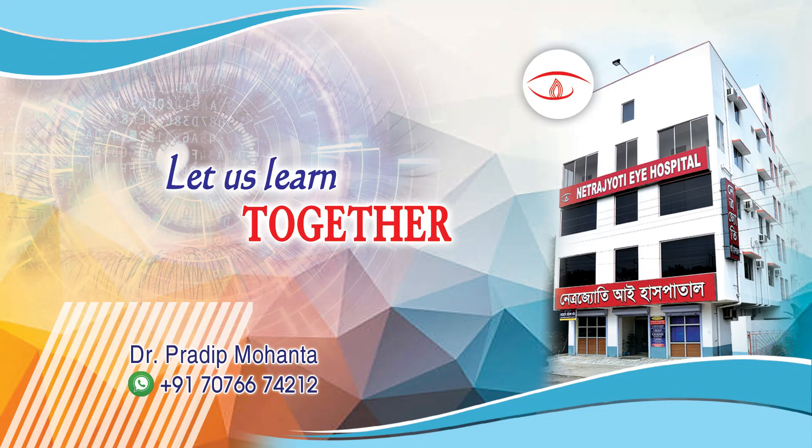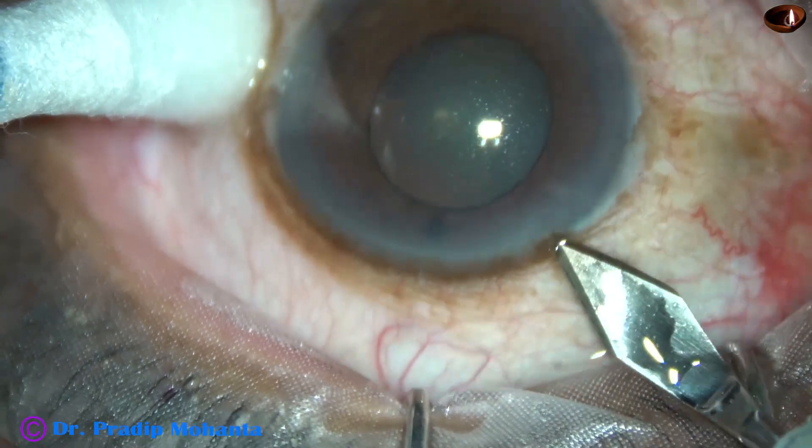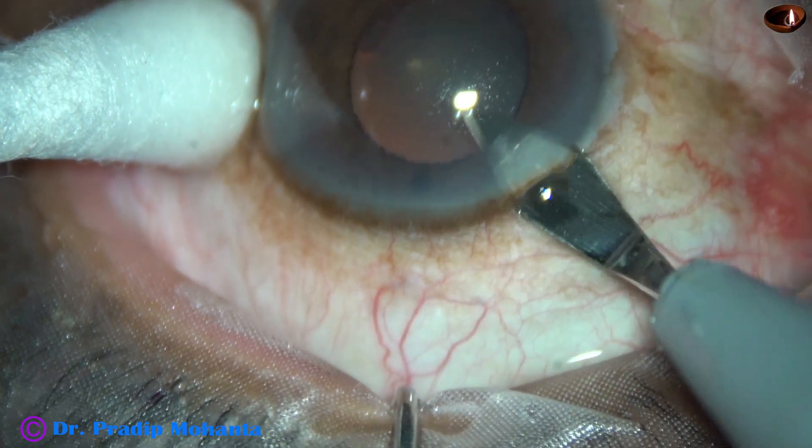Friends, in this video we are going to see how to manage a soft cataract with small pupil without using any pupil expansion device.